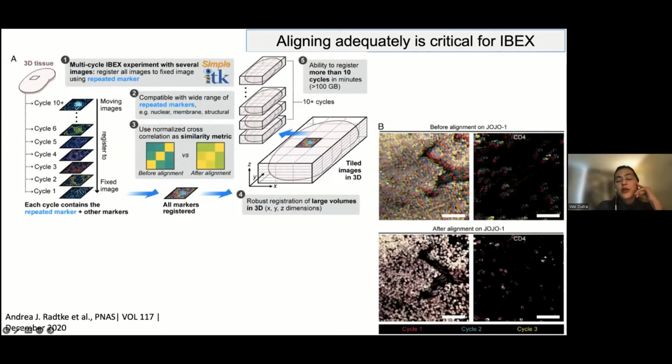So for example, you have the expression of your fiducial markers that you know would be in the same place, and then you will use that to be able to align. So you're going to lose the blurriness of the many different markers once you put the fiducials right on top of one another, and that will resolve the staining for you. So that is a critical moment.